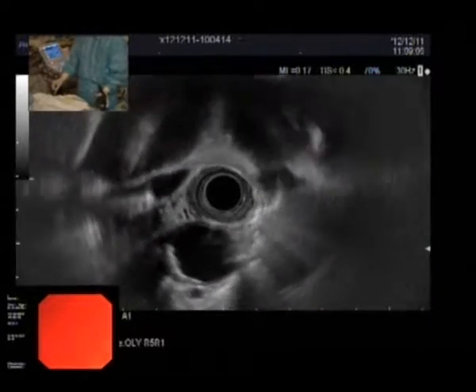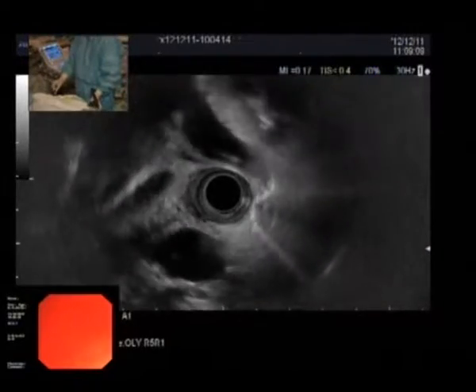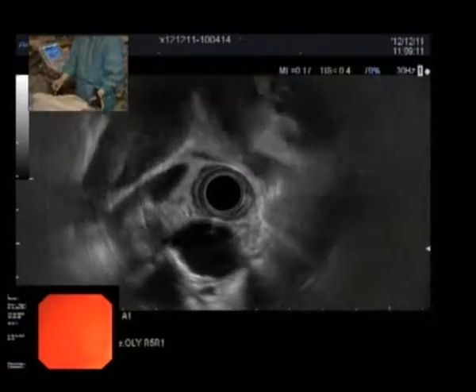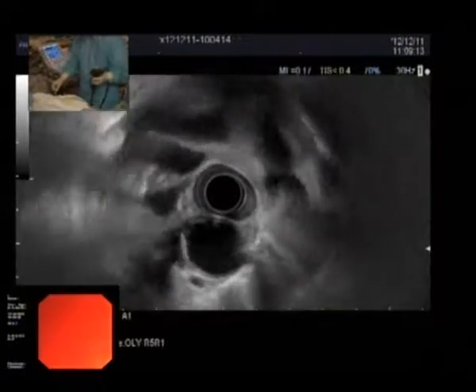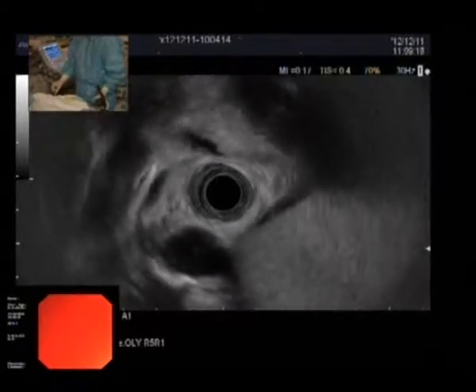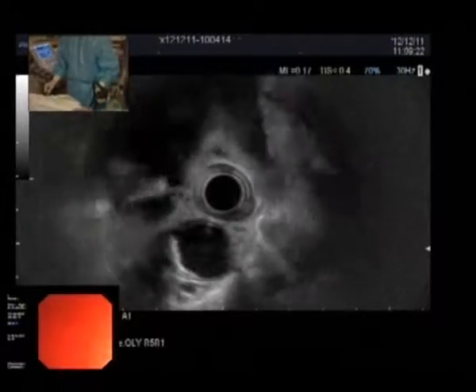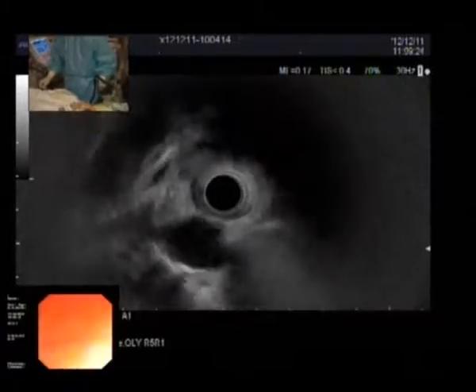I know that Rapport is a big fan of arterial tracing, so I think during this course he will show the arterial tracing technique. I'm going to show you the endoscopy guided pancreas tracing and liver tracing.